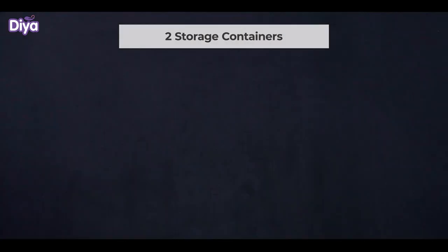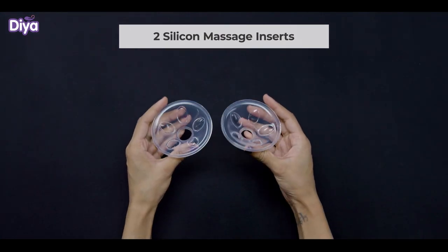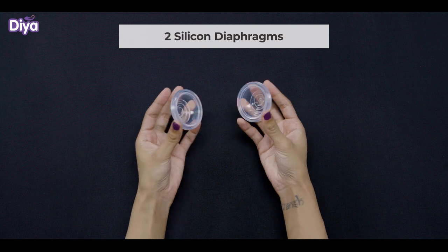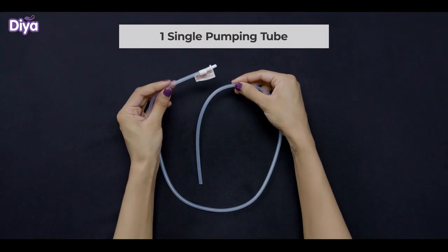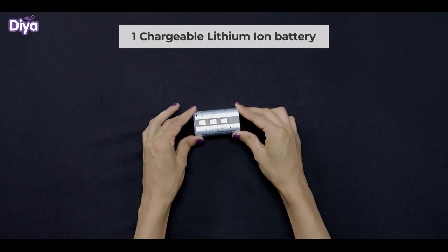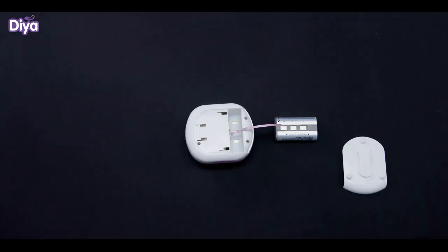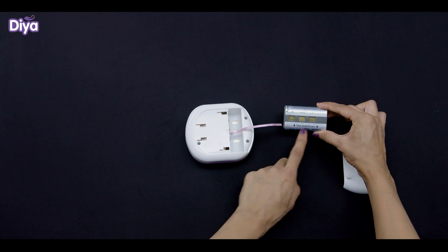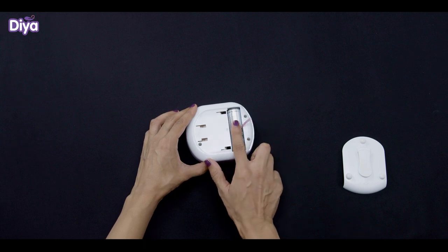In each package you will find the Motor Unit. To use the product, start with inserting the lithium-ion battery into the motor like this by matching it with the golden conductor. Keep a part of the ping string outside like this so that you can remove the battery easily.